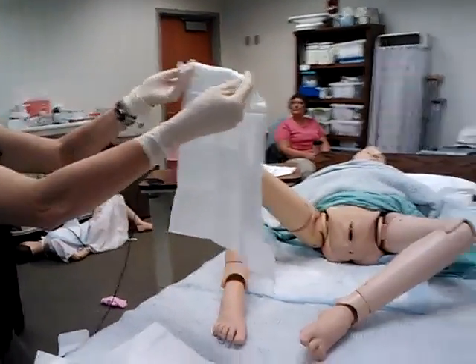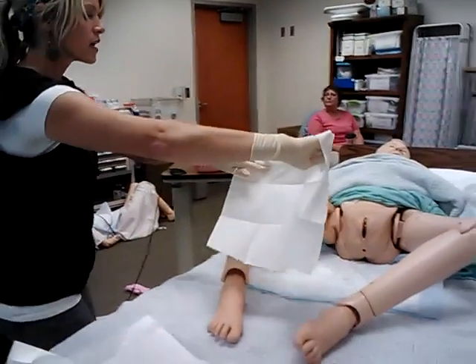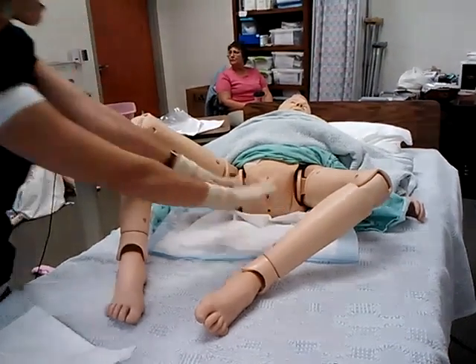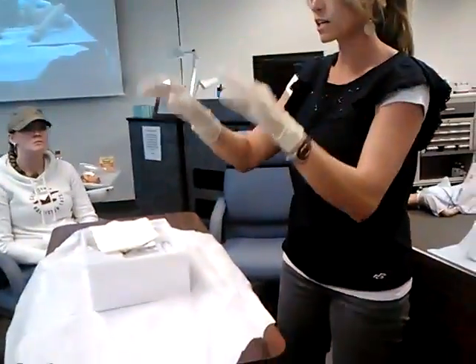So you have your sterile drape. You roll it up like this. And then you're going to put it right underneath the patient. But you're going to do that without touching your patient or the gloves on anything, so you're still sterile.